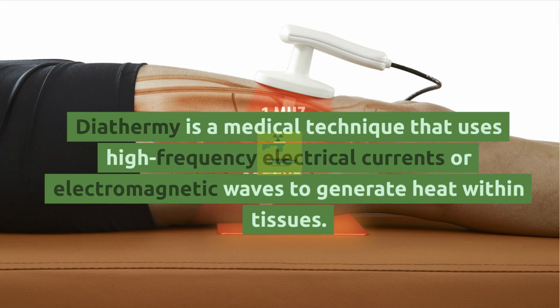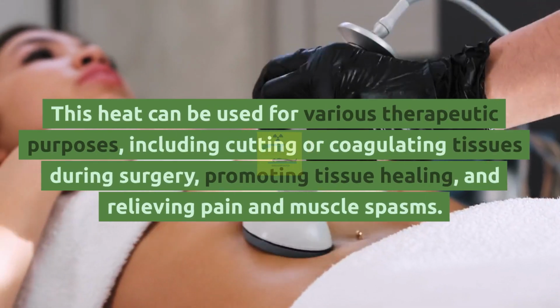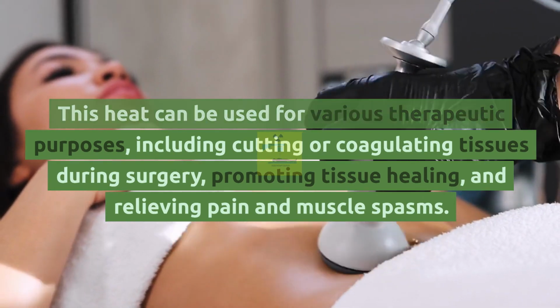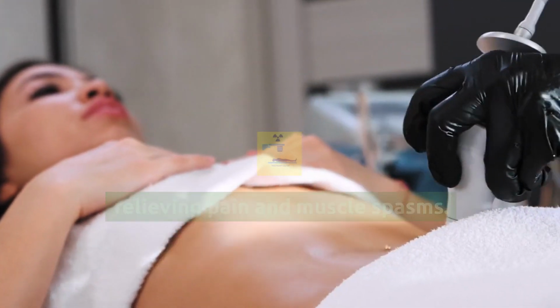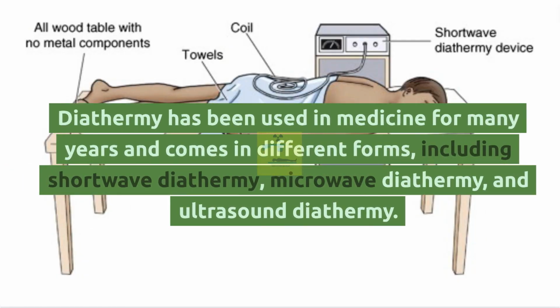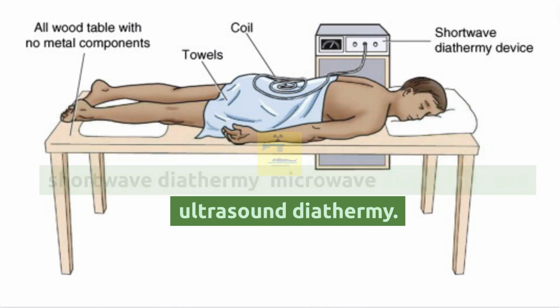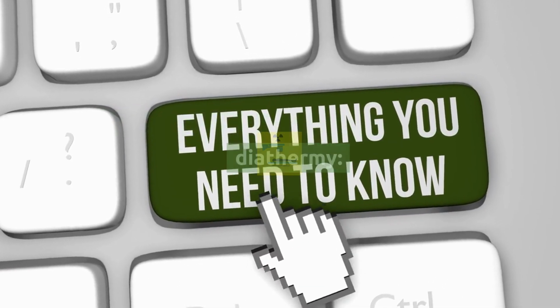Diathermy is a medical technique that uses high-frequency electrical currents or electromagnetic waves to generate heat within tissues. This heat can be used for various therapeutic purposes, including cutting or coagulating tissues during surgery, promoting tissue healing, and relieving pain and muscle spasms. Diathermy has been used in medicine for many years and comes in different forms, including shortwave diathermy, microwave diathermy, and ultrasound diathermy. Here, I'll provide a detailed overview of diathermy.